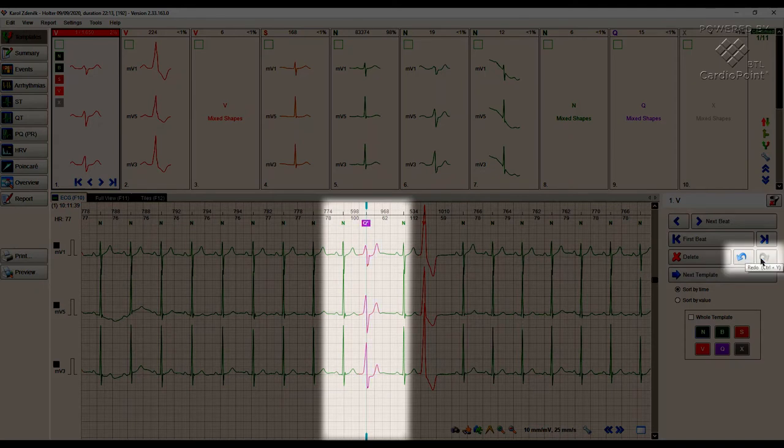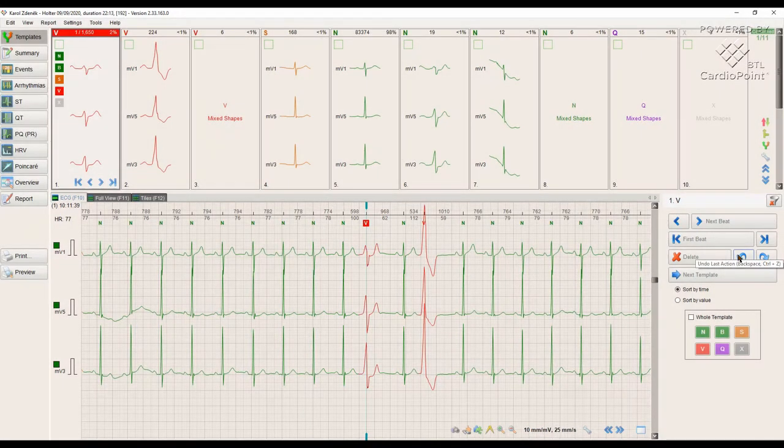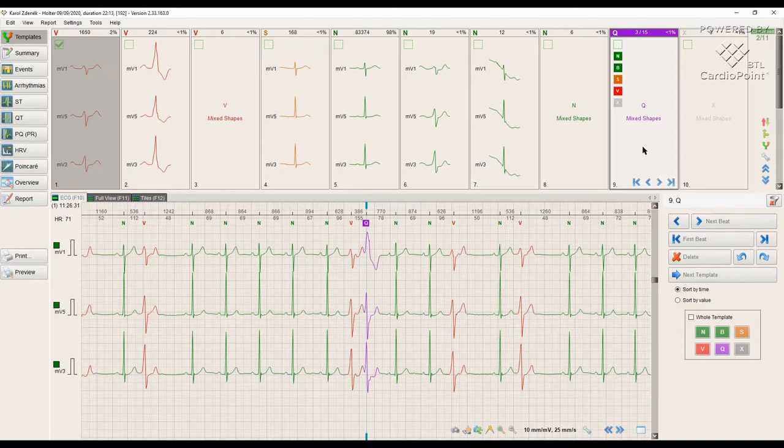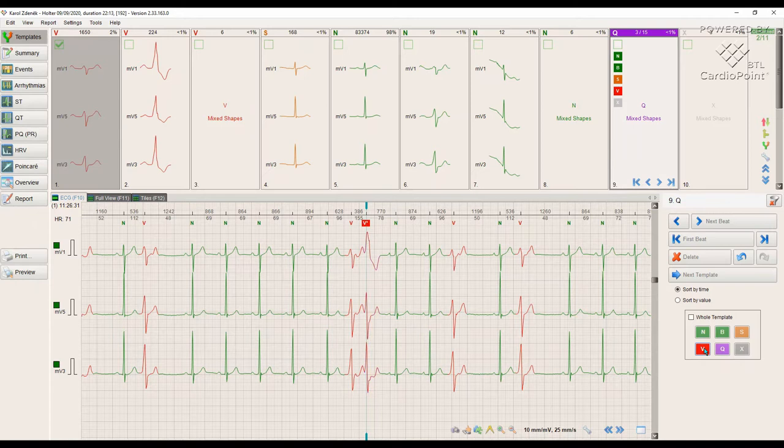We can also use a redo button to restore the undone action. It should be noted that the templates indicated as a letter Q should be carefully reviewed, since the templates may contain diagnostically significant beats that doctors need to determine by themselves.